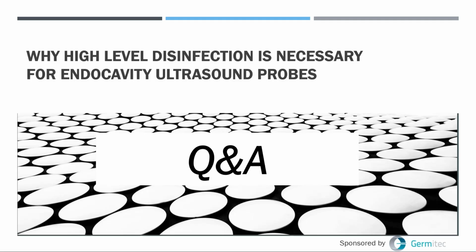But it is a major concern that there are some studies showing that some of the FDA-approved high-level disinfectants may not completely inactivate HPV. And as I've noted already, UVC light will, with sufficient time and energy, which is built into the UVC device we've discussed, will completely inactivate HPV, as they will inactivate all other microorganisms, although they will not necessarily inactivate 100% of the spores at the time that's being used on these devices.